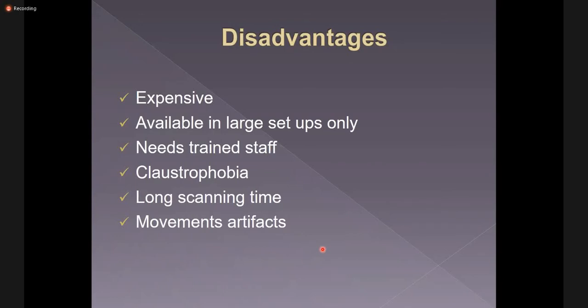Sometimes the patient can feel fear. There is also a long scanning time; MRI takes a minimum of 20 to 25 minutes per patient. The patient has to lie still, with no movement and shallow respiration.